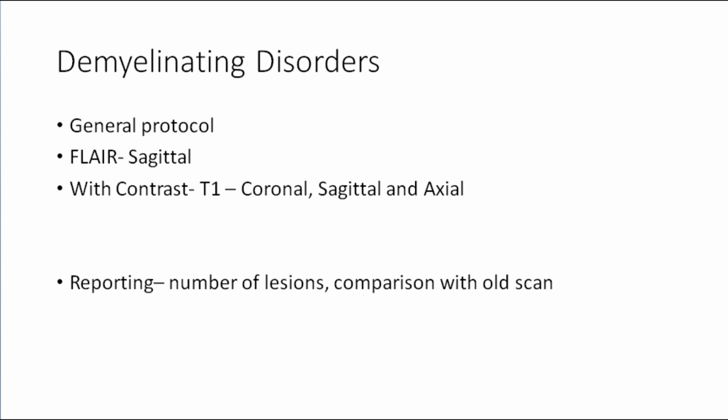So again, this sequence should not be missed in these patients. It should be included in that particular template, and it saves time. And when you report it, what happens, it happened even recently: radiologists reported there is evidence of demyelinating disorder. Oh guys, I know this even from 100 miles, this is demyelinating disorder. This is a repeat scan. You have to tell me the number of lesions in comparison with the old scan. If you're not doing it, you're not justified. Patients are not there just to pay.